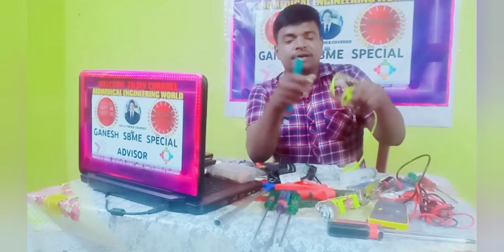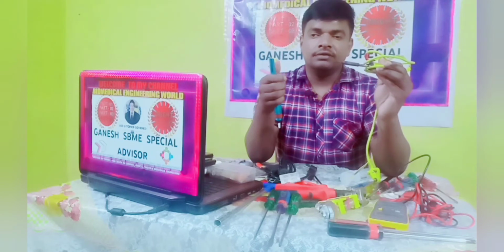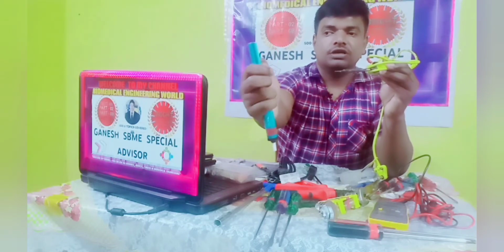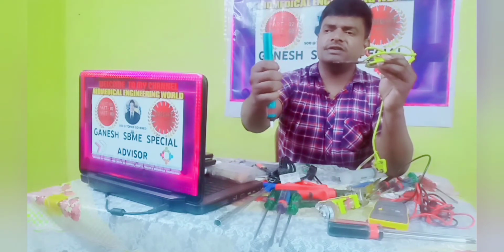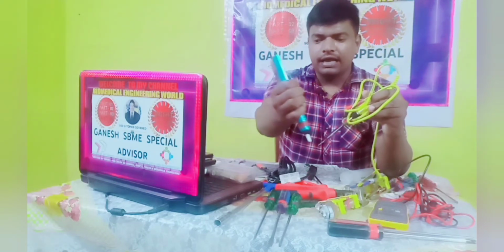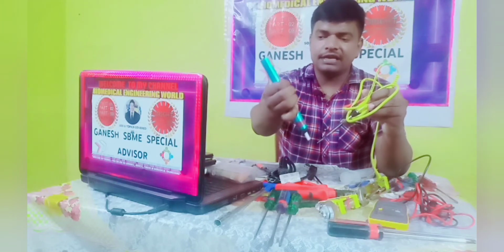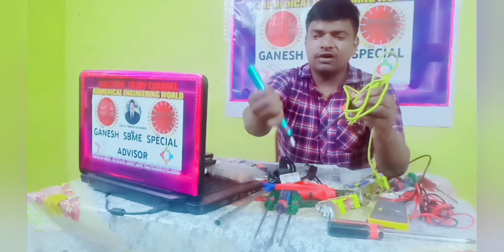By operating the desoldering system. See, this is the desoldering system, for the desoldering purpose. What is desoldering? When soldering components in electronic devices, in electronic medical devices, electronic components are available on the PCB. So in the PCB, if a component is placed in the wrong place, then we need to replace it.